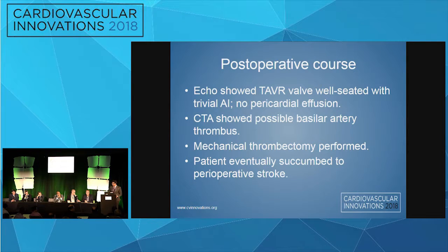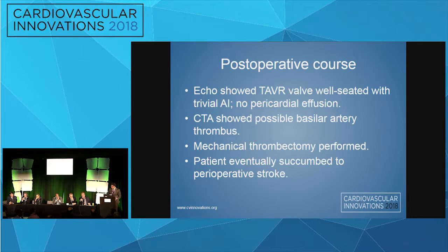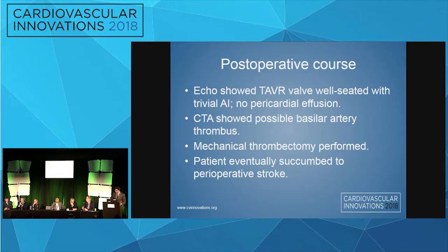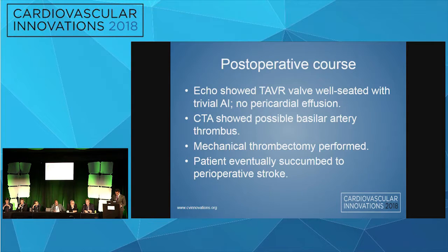Well, that's great, Ankur. These things happen with every single case, right? So we've had strokes. And I guess we're becoming more convinced that Dr. Kapadia is correct, that we should try to think about defaulting to some device that is going to provide cerebral protection. There's certainly a number that are in the works. But I actually don't think it was an issue of the Sapien versus the Evolut for getting up and around. You probably would have been maybe easier, but you still would have been navigating the same territory with the Sapien. So that's good. All right, okay, thank you.